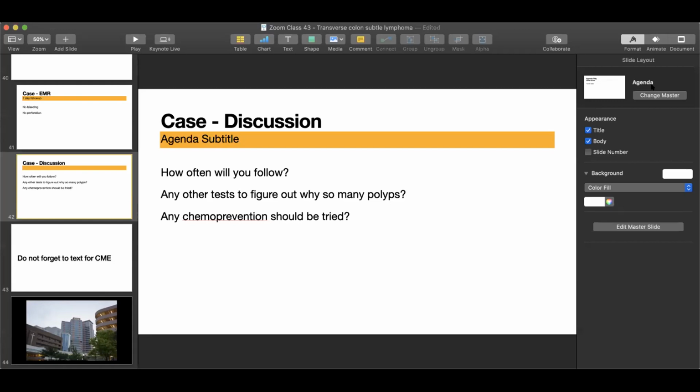So of course, we were not aware that the PD colonoscopes didn't have near focus. But I will reach out to Joe Hearn from Olympus, and maybe we can discuss with Denise and see what we can do about it. We can probably at least get one or two. Yes, I think that's a good idea. I didn't realize that. I was under the impression that PD scopes are not designed to have a near focus. Me too, I was under the impression that they would have near focus, but I guess they do not. I will definitely reach out. We'll discuss this with Denise tomorrow morning, then I will reach out to Joe and keep you updated. Thank you so much.